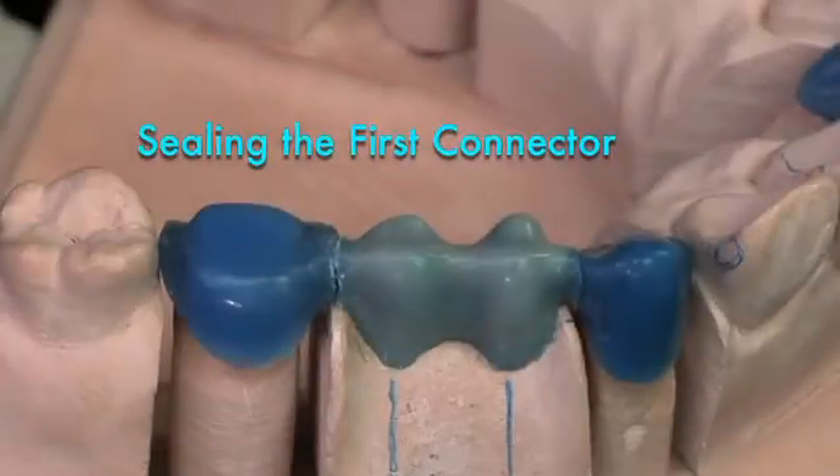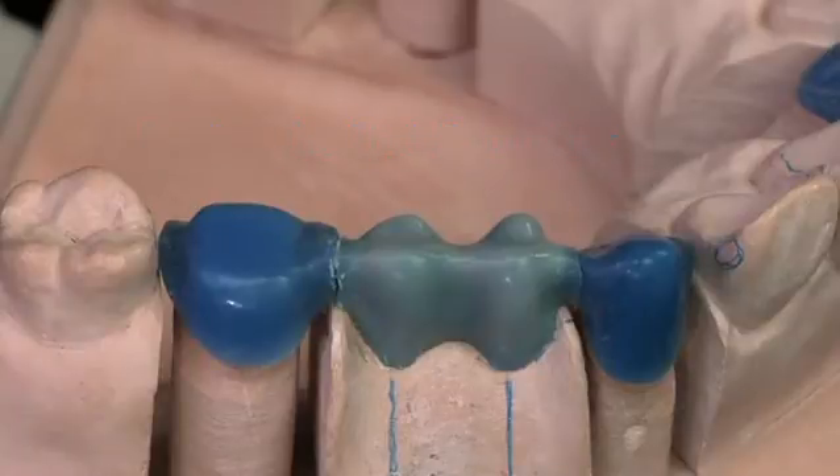Here I have a wax pattern for a four-unit framework. I've cut the pontics free from the abutments so that I could easily finish the margins of the abutments. I've reassembled the pattern on the working model and I'm ready to rejoin the parts and place my sprueing.